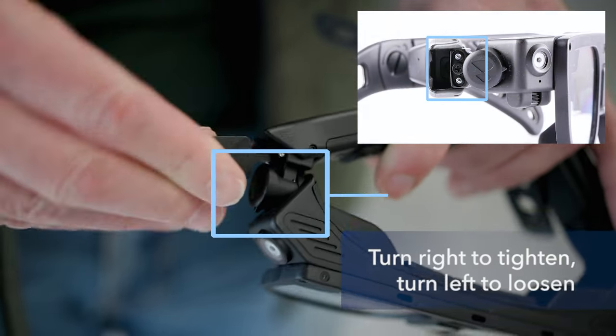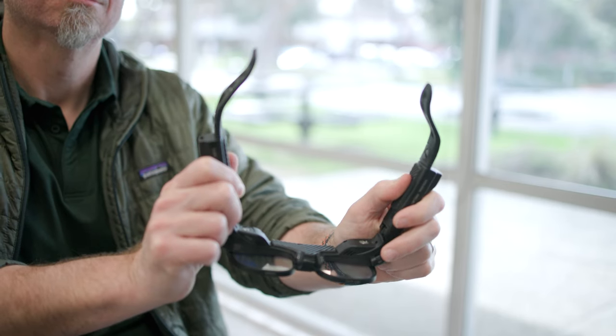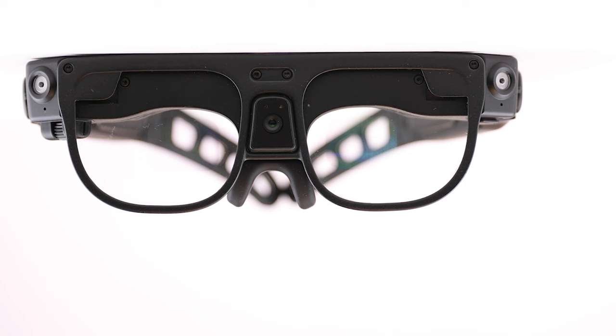Using the adjustment tool, you can either loosen the screws on either side for a looser fit or tighten them for a more snug fit. Try to adjust both sides evenly so the glasses sit centered on your head.